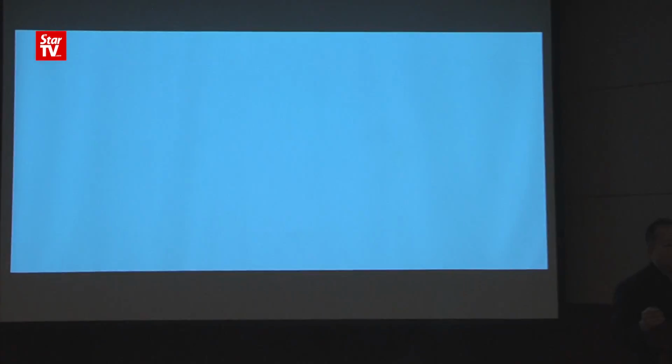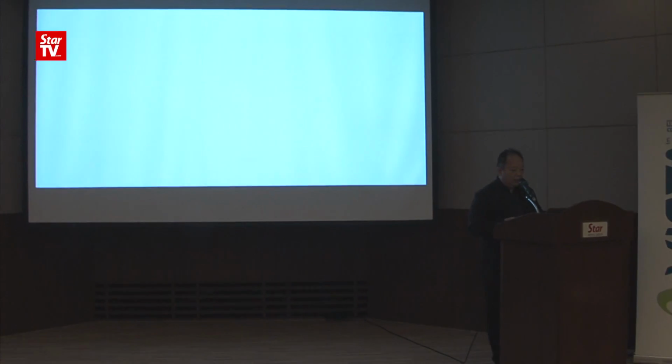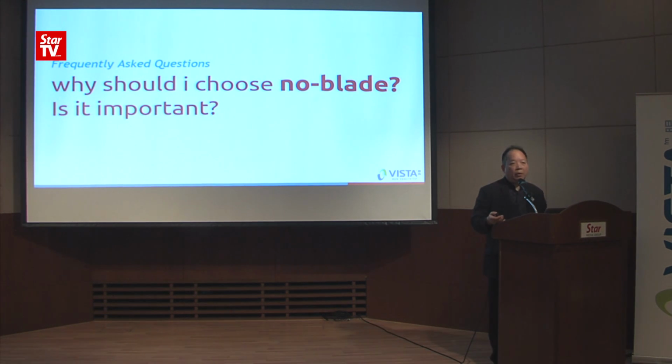That machine is the Femtosecond laser machine. Now, a person has cataract, he has to make decisions. Does he want to choose the blade technique or the no blade technique? Is there a lot of difference? Well, technique-wise, there is a lot of difference. Steps that require the surgeon to manually make the incision or make an opening are being replaced by the high accuracy and precision of the Femtosecond laser. So accuracy and precision translate to safer surgery.